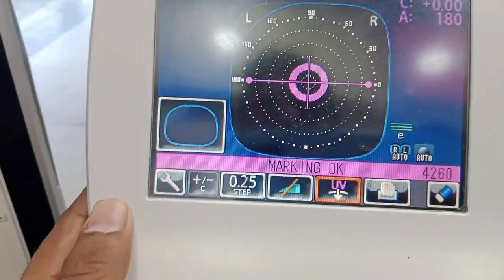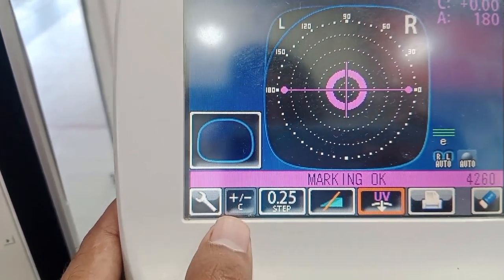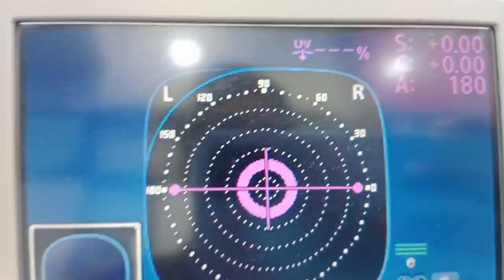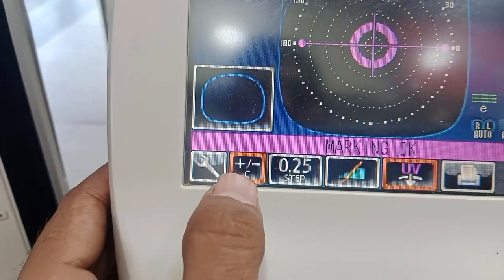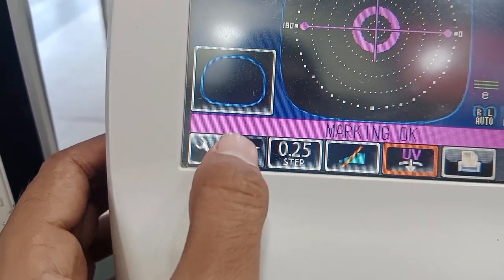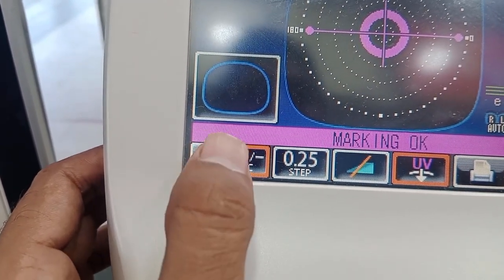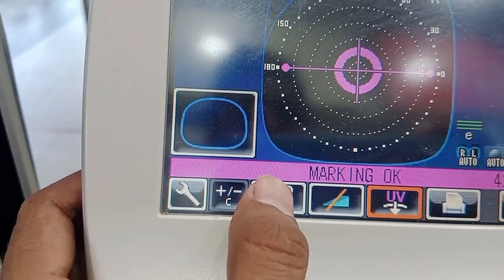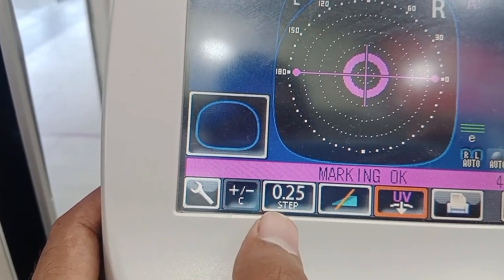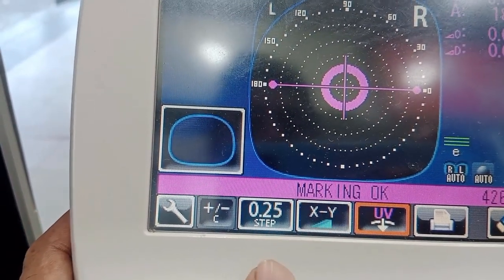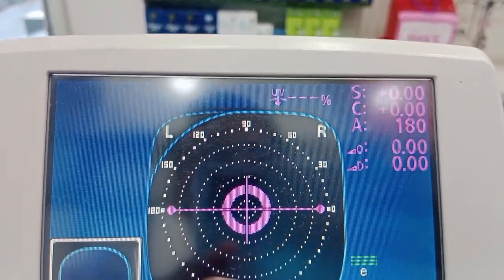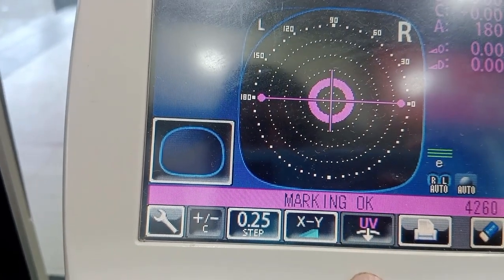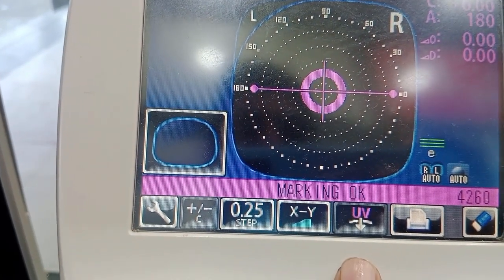The next setting is for the cylindrical form — you can choose cylinder in plus form or minus form, and you can transpose the value. This setting allows you to choose plus or minus cylinder based on your preference. The next is the step size — you can go for 0.01, 0.12, or 0.25 step; 0.25 step is standard. There is also a setting for prism, which you can use if your prescription carries a prism, and a setting for ultraviolet detection to check the UV property of the lens.